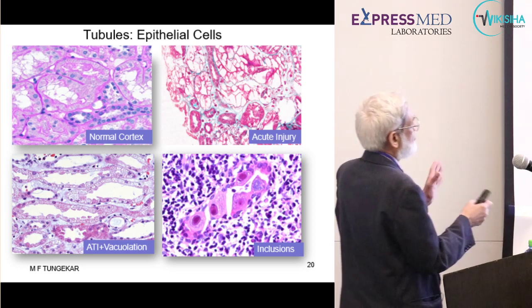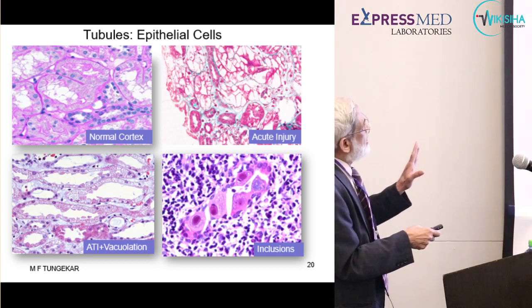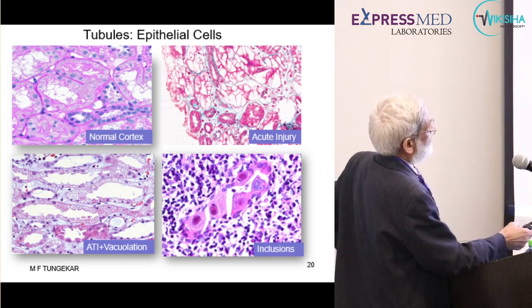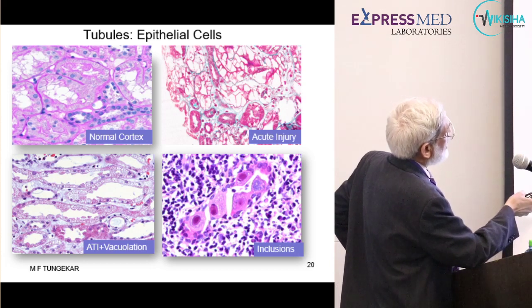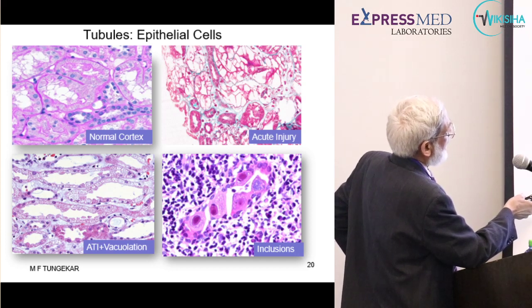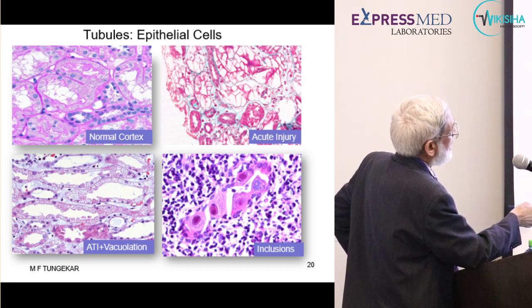It is important to recognize the difference between the two, because some conditions that affect the proximal tubules can be easily identified then. You know what a proximal tubule is. For example, here, acute tubular injury, the case of ethylene glycol poisoning, antifreeze. And there, proximal tubules cannot be recognized at all. Cells are big, but there are huge vacuoles within the cytoplasm. Also, the tubules that are not affected are mostly distal tubules with acute injury.